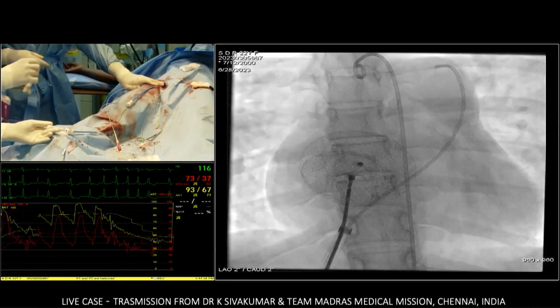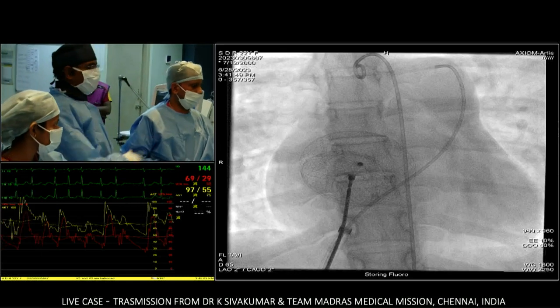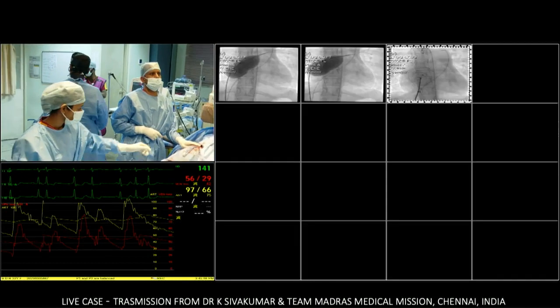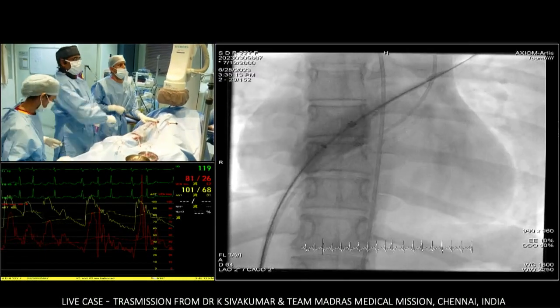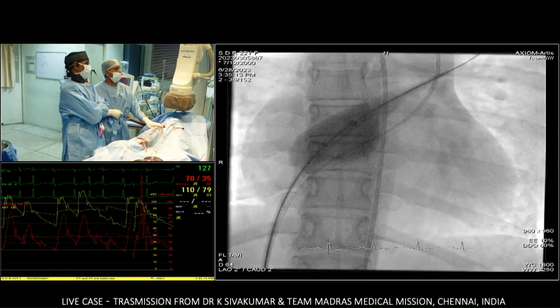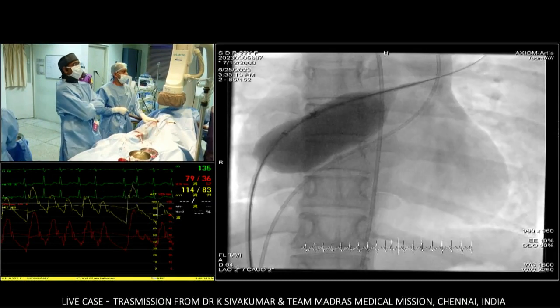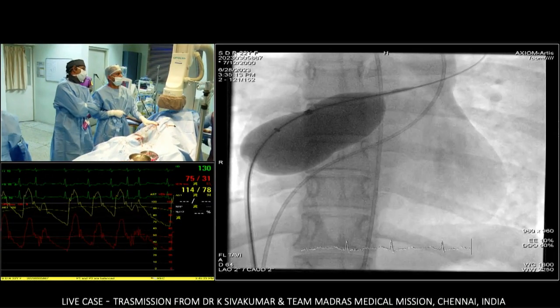Okay. Now fluoro store this and repeat this. Now Srija will show echocardiography. Has anybody made a measurement of this waist now? You didn't monitor the device release by echo, you just see afterwards, right? Yeah, based on fluoroscopy, Mario. Once upon a time, we used to do it only based on fluoroscopy, no?